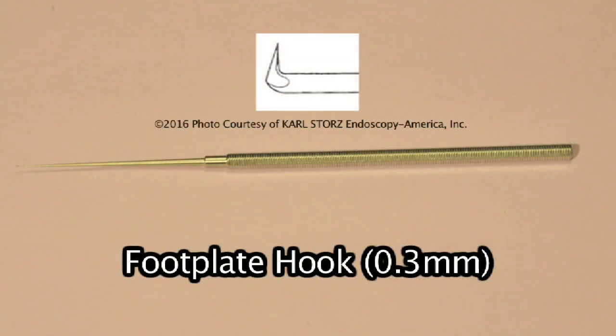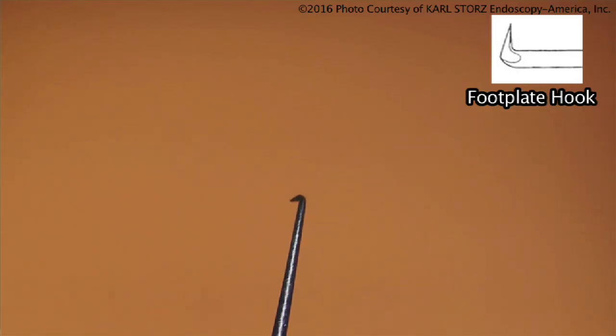This instrument, which is very difficult to see, is a very small footplate hook. It was used primarily in the early days of stapedectomy to remove parts of the footplate. They were angled — one was called an anterior and the other a posterior, bent in the other direction. Being left-handed, I had to ask for the opposite.